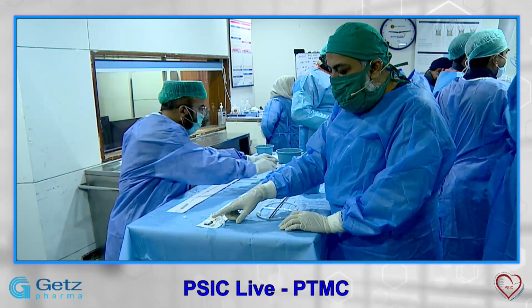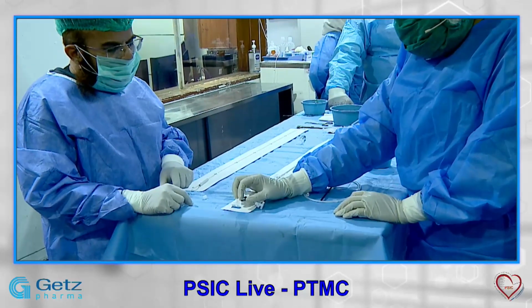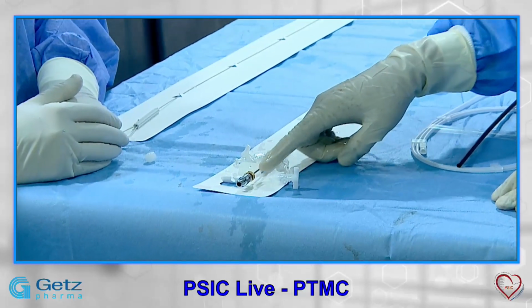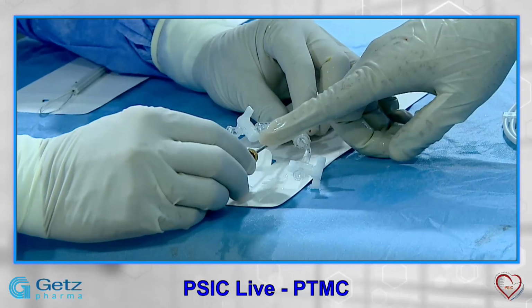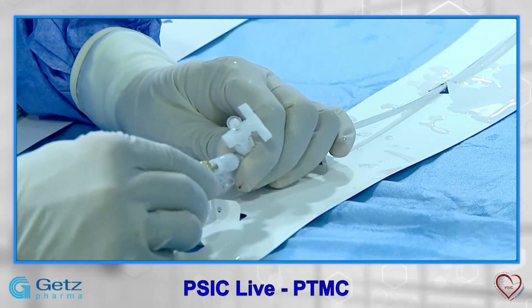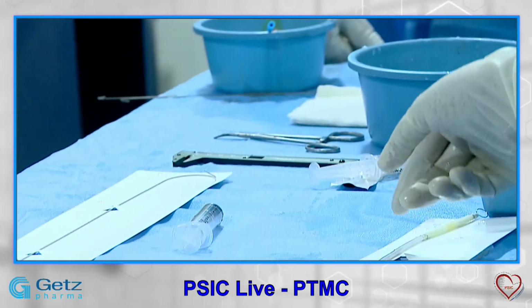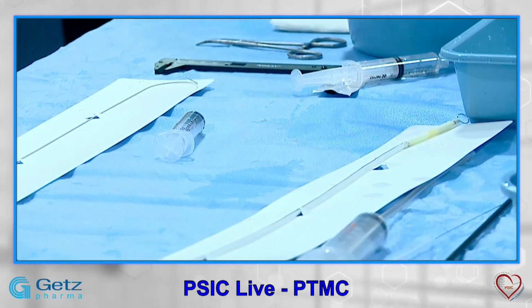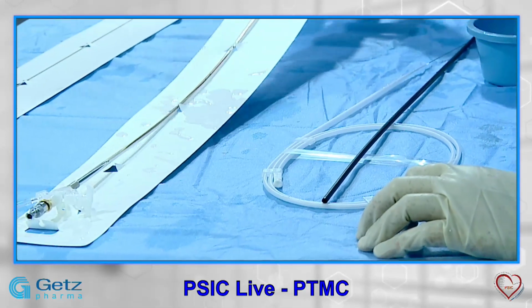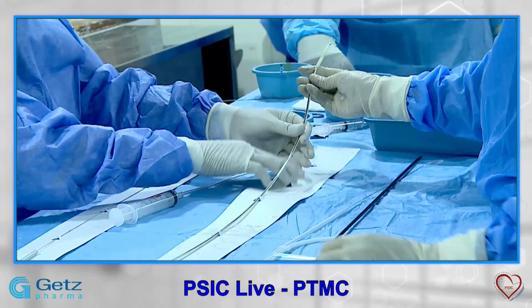This is the silver hub. Usually we are used to calling them silver hub and golden hub, but this is basically the true terminology. This is the straightener, and this one is the stretching tube. The role of the stretching tube is that once you close it, the balloon will be in a stretch position, because when we are crossing through the septum and coming back through the septum, the balloon should be in a stretch position. If the balloon is not in a stretch position, please release it.